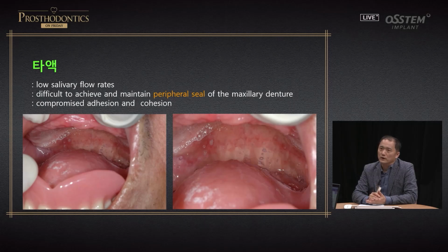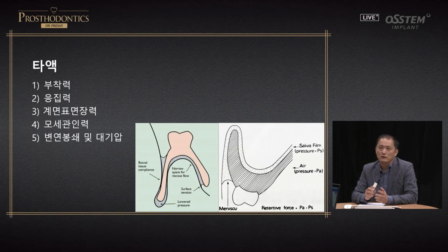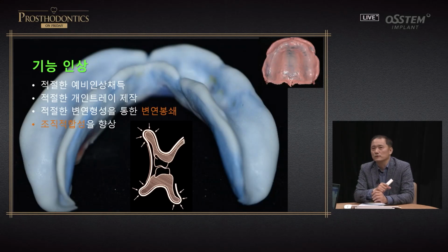Next is about saliva. Saliva is also a very important element between the tissues and the full denture. Saliva actually gives retention power, and as you know, five principles are involved. Saliva contributes toward retention, but saliva is not always good for retention, especially if it is too sticky, or it moves. Sometimes it shakes the full denture. So an adequate level of viscosity is sometimes more important.